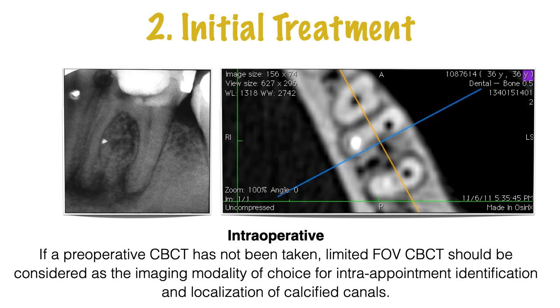something that's radiopaque. It's an amalgam chip. So amalgam wasn't completely removed before access opening. A piece of amalgam fell into the canal and was blocking the canal, and this is an axial view of CBCT. This is a CBCT with a larger voxel size, so it doesn't have a very good resolution, but you can clearly see the amalgam here blocking the mesiolingual canal. Can it be removed, bypassed? Not sure. It seems to be very tight in that canal.